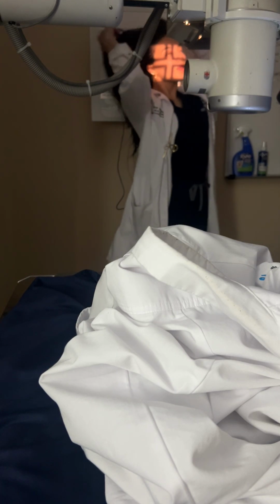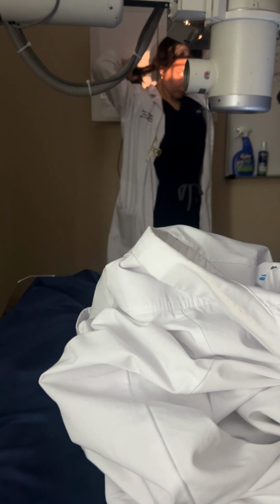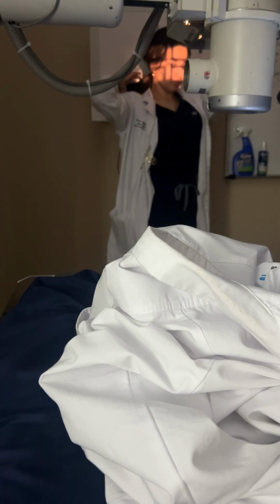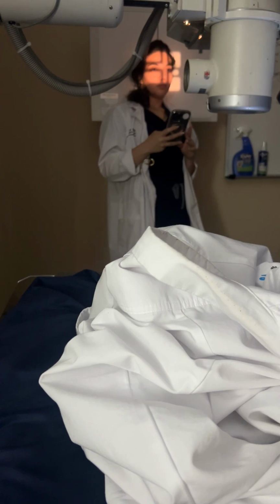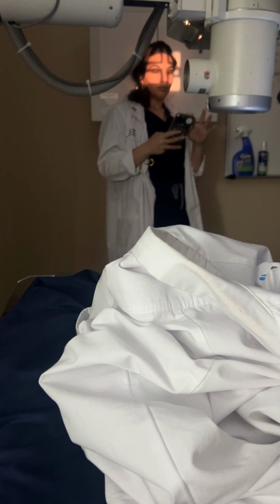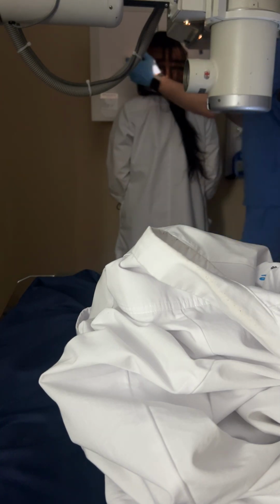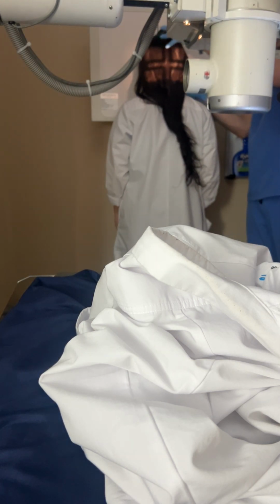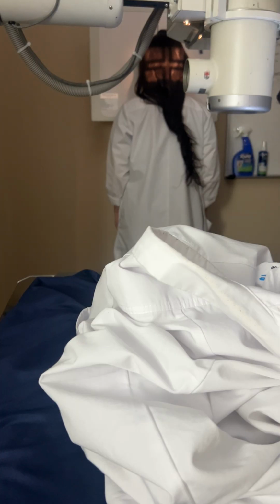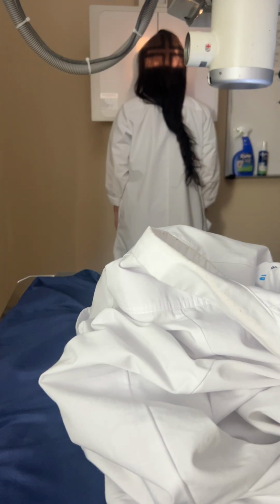Okay, so let's go over the sinus for the Caldwell, or the Caldwell for the sinuses, one more time. Do we angle the tube? No. Let me make sure I've got that right. Great, great. Okay, turn around one more time. So, OML is normally perpendicular. We're going to add a little more to that. So basically going to have her kissing the board. Nose and lips are touching almost. Still exiting nasion.